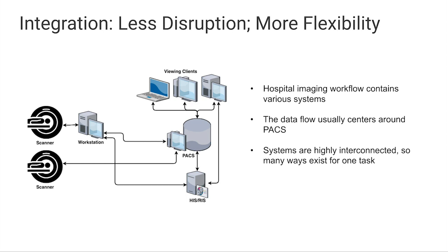So as you just said, clinical IT systems are usually quite complex already in today's hospitals. It usually involves a number of different entities, usually the software or services in their network settings. Important players involve scanners, PACS, hospital information system or radiology information systems and viewing clients.